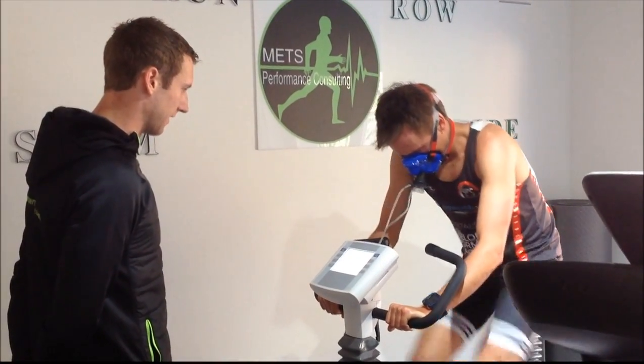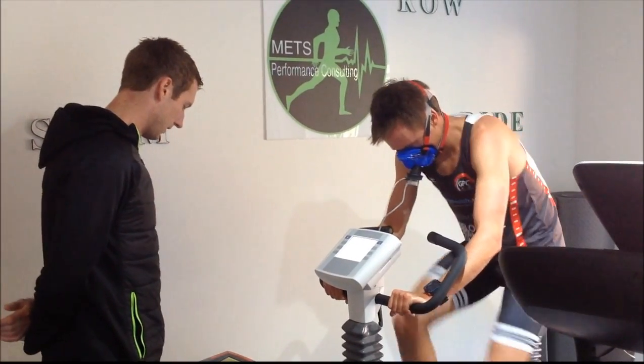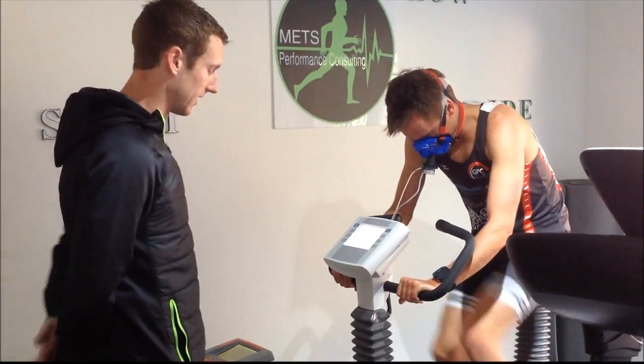Alright mate, 345 — cook it out. Heart rate 182, sitting over 70 now, come on. Good job.